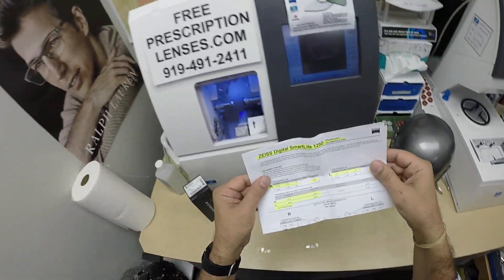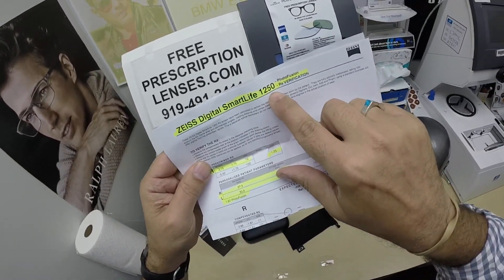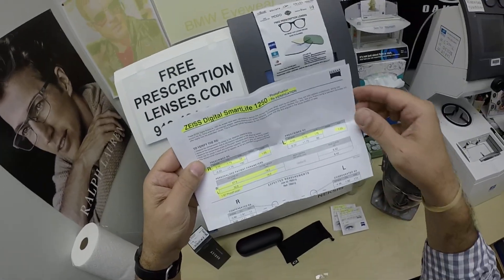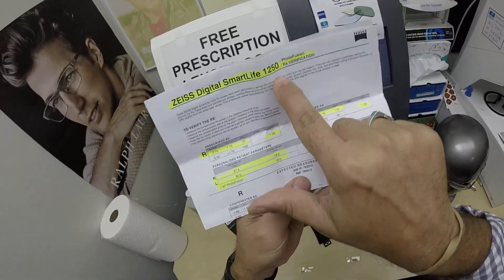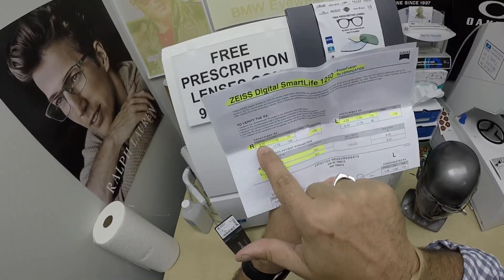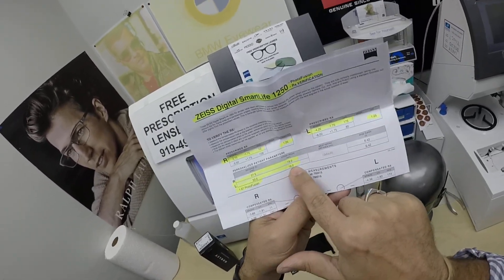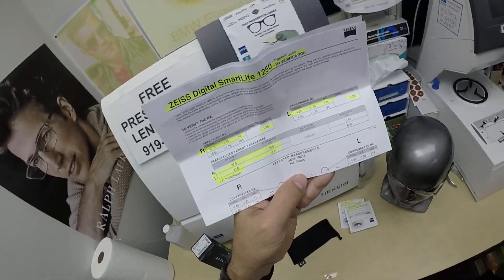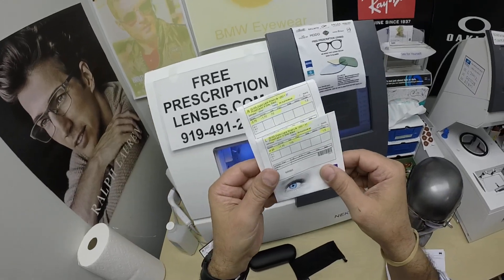Dan got the Zeiss Digital Smart Life 1250, known as the Digi Boost. It has a digital extra boost of magnification at the bottom of the lens — 1.25, the 1250. I've highlighted the prescription for the right eye, same for the left, along with the pupillary distance and optical center height. These are 1.67 high-index photo fusion gray lenses with DuraVision Platinum. These are the packets that the lenses came in.